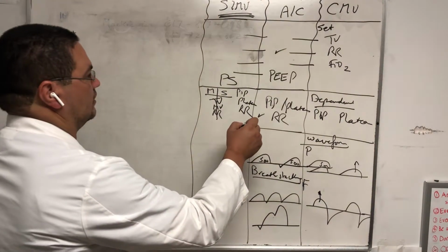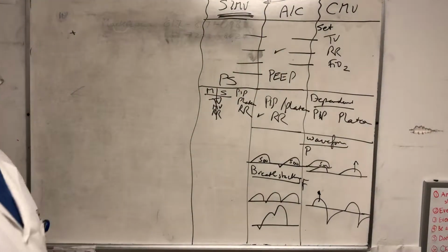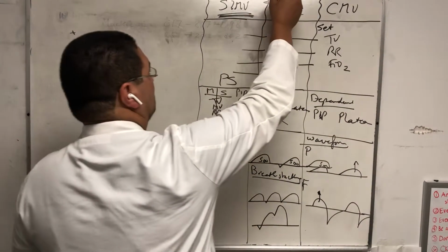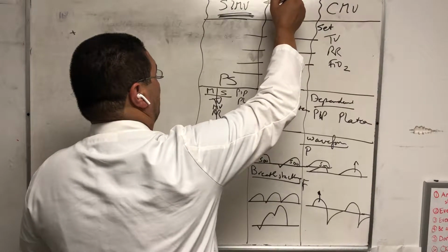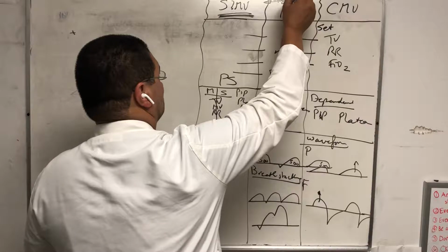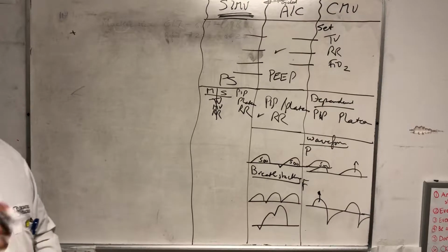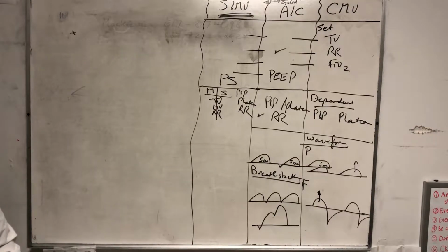So basically, between the 70s and 90s, there were a lot of modes of ventilation that were developed. Between 1970 all the way to the 1990s, one of them is called IMV, and there were time-cycled modes which were similar to bi-level, but the vents were kind of sticky and the valves were not working, so it didn't work out. And then the 90s obviously were the mode of the SIMV. So if you think about the 90s, that's the SIMV time.